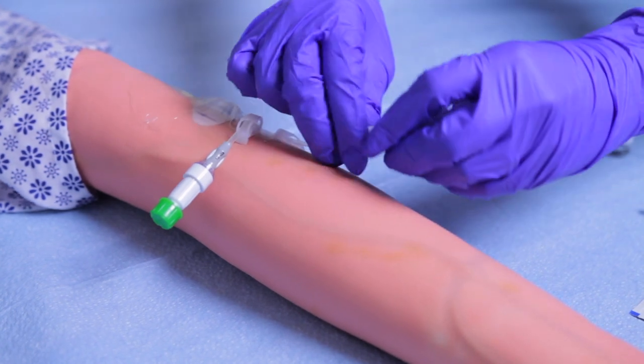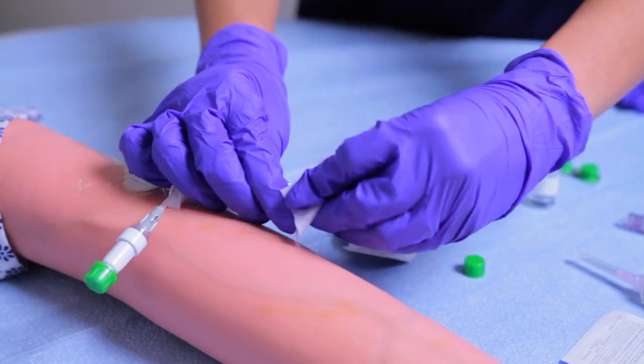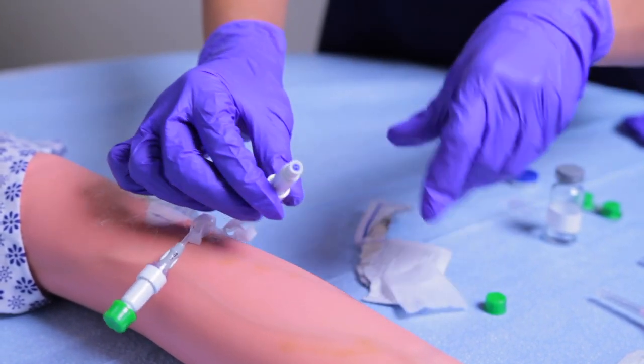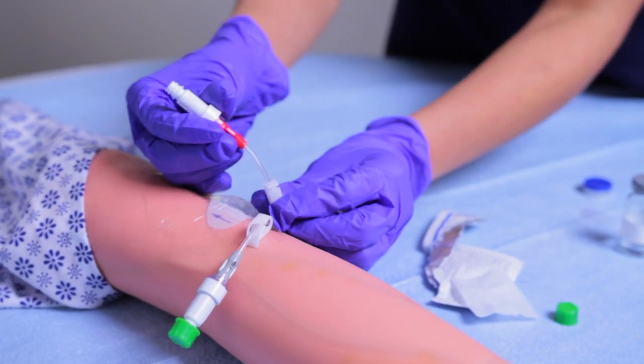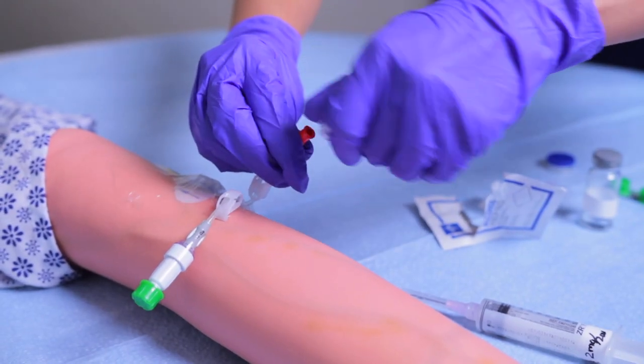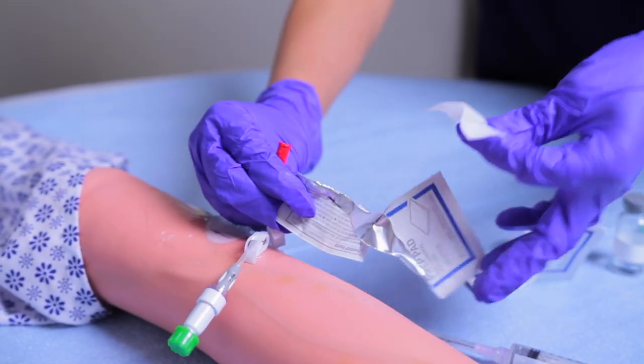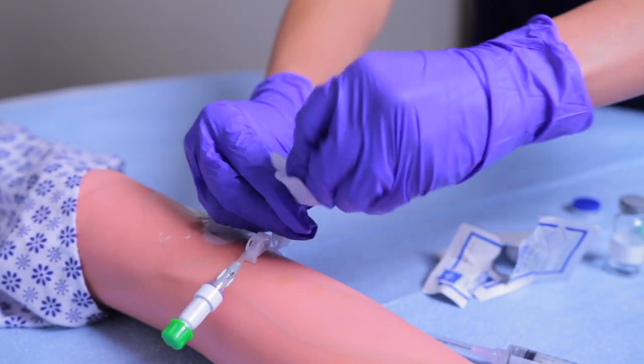Step four: clean the hub with a vigorous scrub for at least five seconds using an antiseptic pad on the affected lumen. After scrubbing the hub, allow it to dry completely, then clamp the PICC line and disconnect the needleless connector cap. Clean the cap with a vigorous scrub for at least five seconds using an antiseptic pad and allow to dry completely. As a side note, for total occlusion, you add a stop cock to the port.